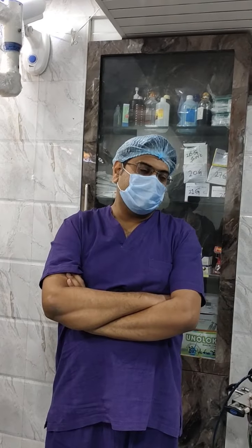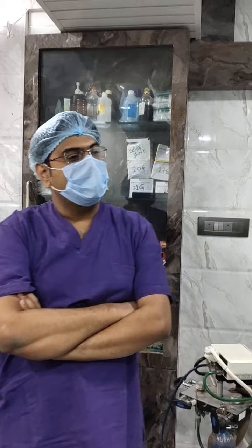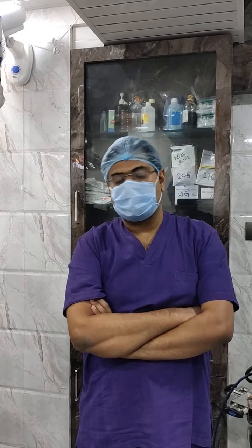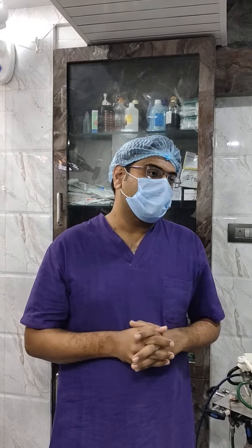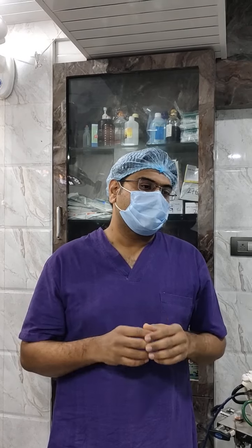So it's day 2 of our workshop, and yesterday we did a first sitting on the patient. We did extraction of the graft, slit making and implantation of the graft. Our experience was quite good. It is laborious work and very technique sensitive, but practice makes a man perfect.